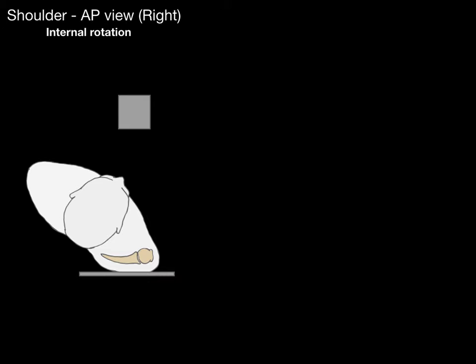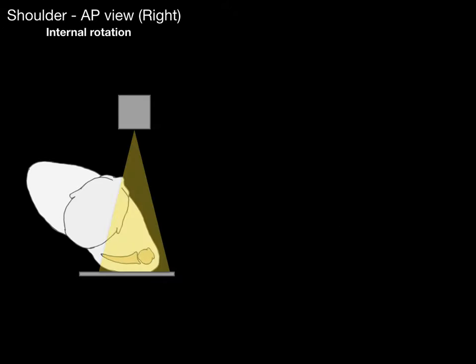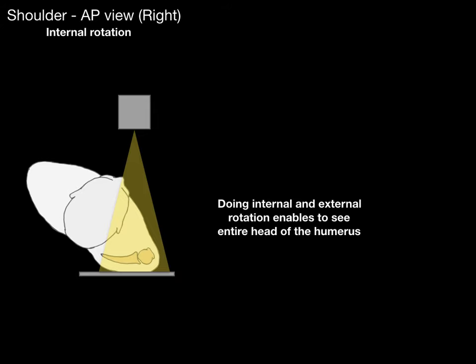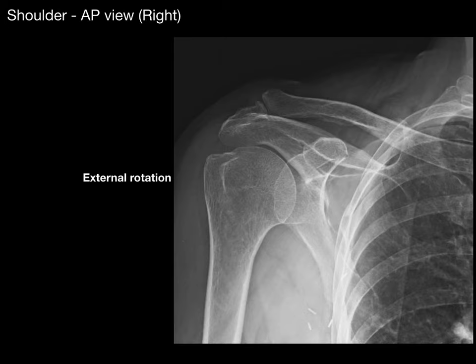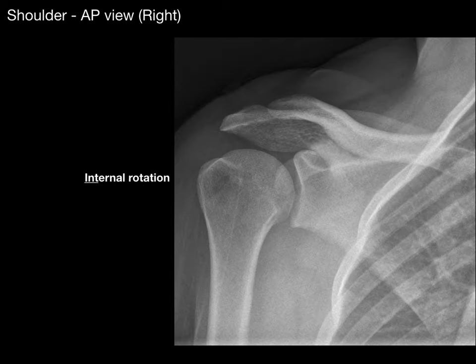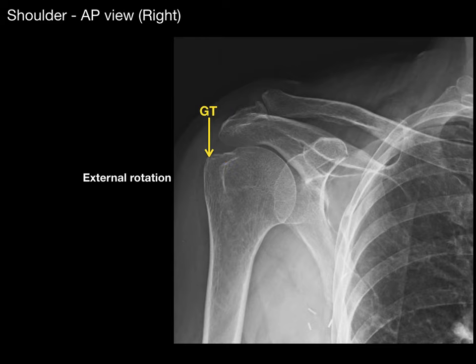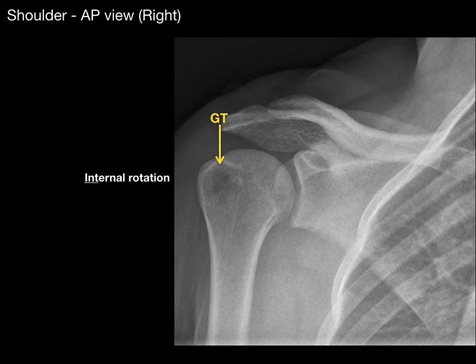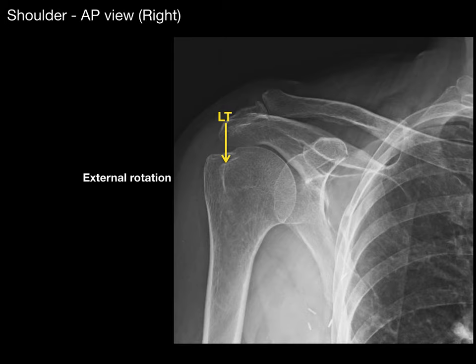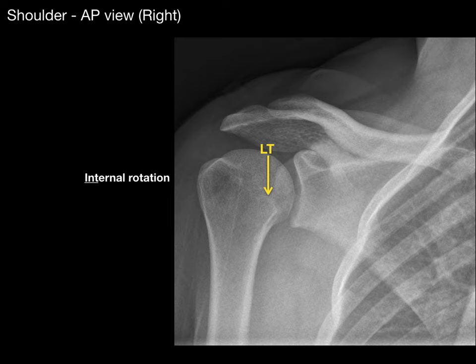Now let's look at the shoulder AP view with internal rotation. The humerus is internally rotated to best see the lesser tubercle. Doing internal and external rotation together enables us to get an entire view of the head and proximal humerus. In external rotation we best see the greater tubercle; in internal rotation it shifts position. The lesser tubercle is also visible in both views, and you can see it coursing more anteriorly in internal rotation.